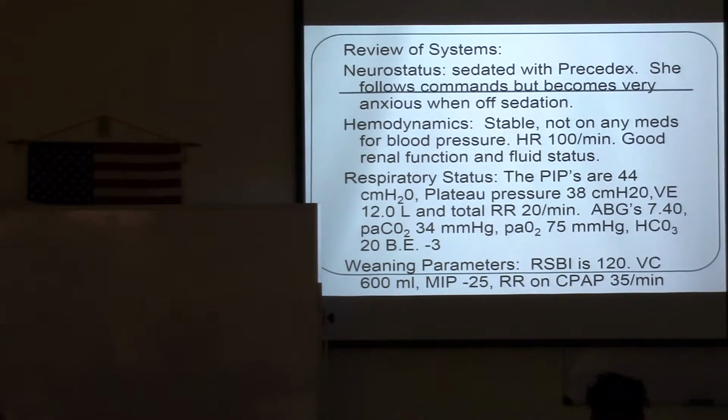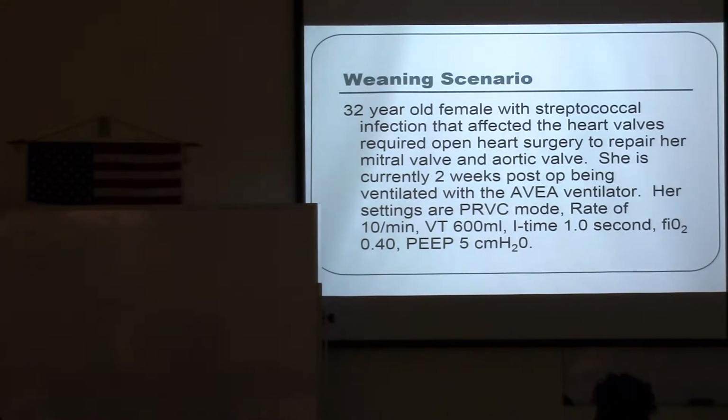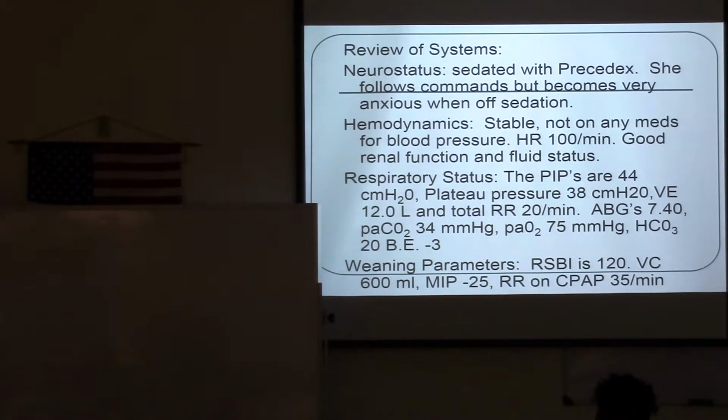All right, so good, you found everything. Oxygenation: she's got a PaO2 of 75. The saturation is... she's on 40% and 5 of PEEP. I guess that part's acceptable, right? We want SaO2 greater than 92 and PaO2 greater than 60, and it is, on 40% and 5 of PEEP. So oxygenation is okay. Yes, she's working hard to breathe, but she's maintaining a normal blood gas. However, we know she's just going to wear out if we extubate her. We expect her to breathe on her own.